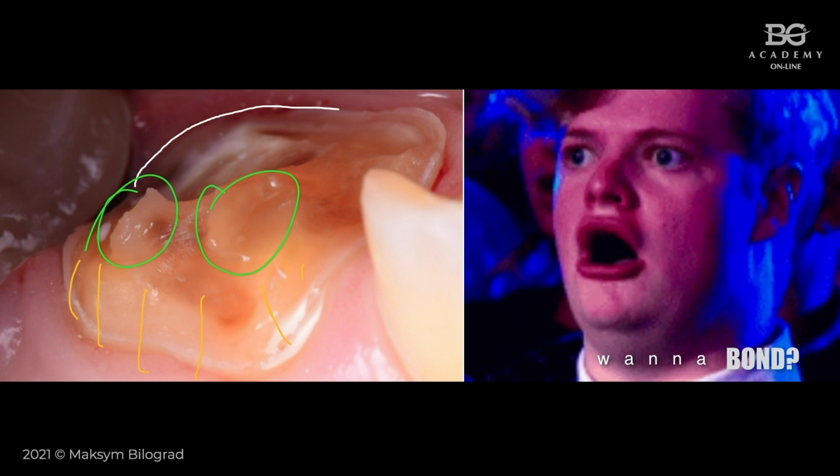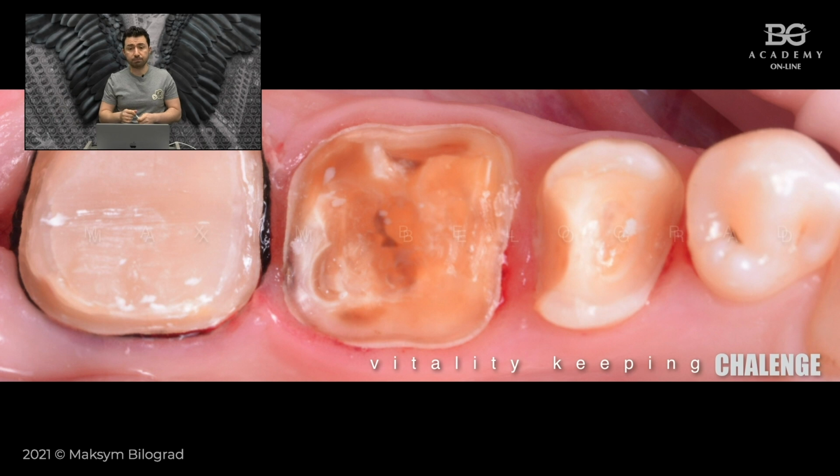I was really thinking what kind of restorative approach to implement in such a case, and then I decided that adhesive dentistry works. There are many articles in our profession proved scientifically and also clinically that you can bond restorations to compromised teeth with no ferrule. For example, this type of restoration is called tabletop. A tabletop restoration is completely plain or flat and there is no ferrule, so they just bond to the tooth surface with nothing.